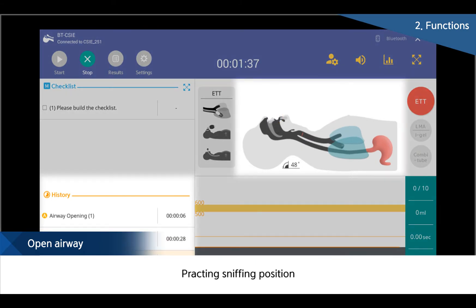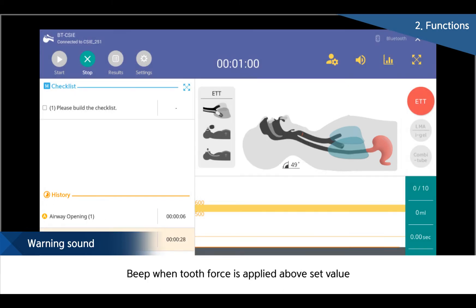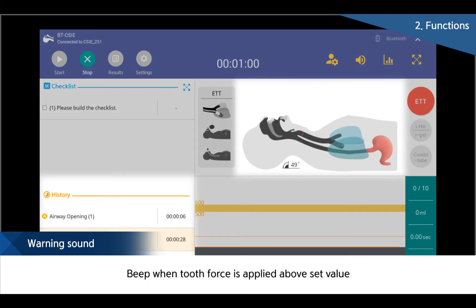Likewise, sniffing positions also can be confirmed, and the display and alarm can be confirmed when excessive pressure is applied to teeth.